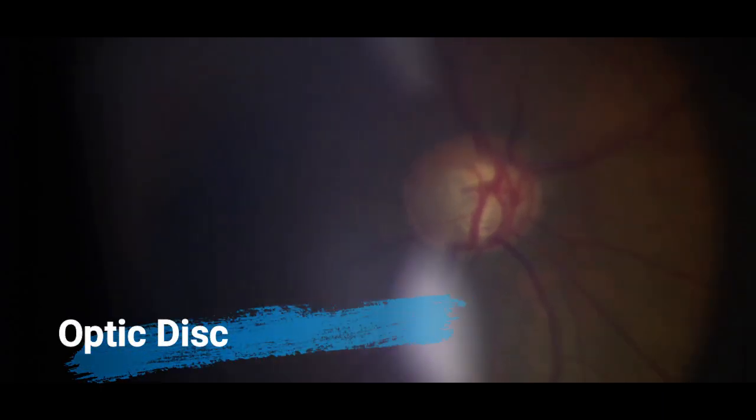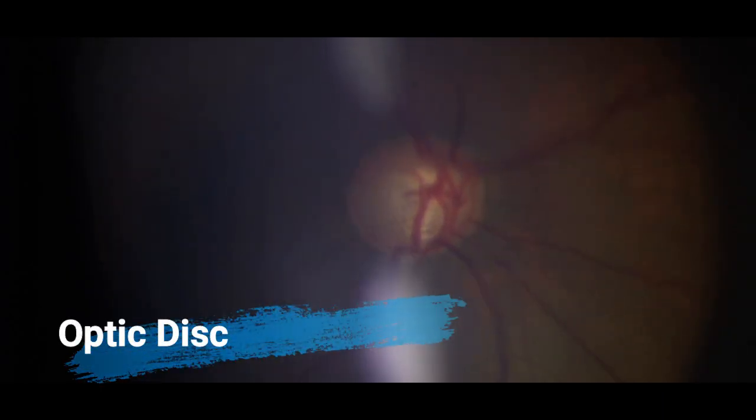In the same setting, we can also use the gonioscope to visualize the optic disc.